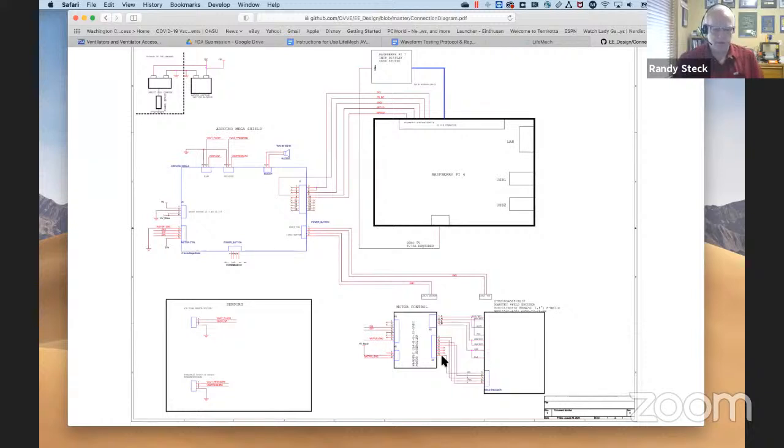So not only is the stepper control loop a closed loop system, but the breathing control system that Jan worked on with the PID algorithm that he coded is also a closed system, so that we have direct feedback and very precise control of every element of the airway.